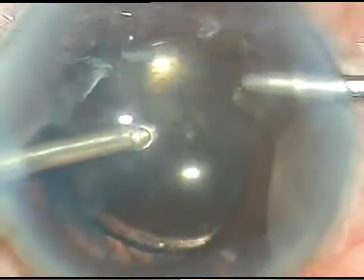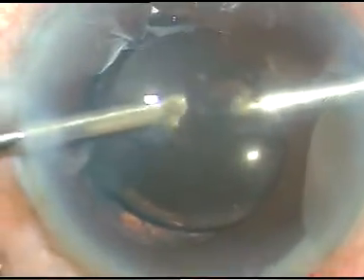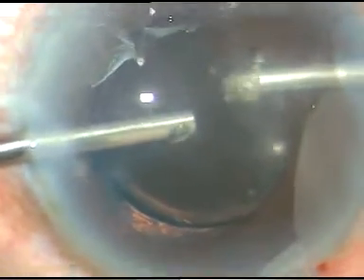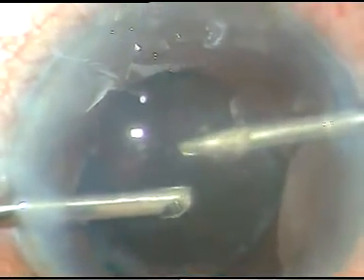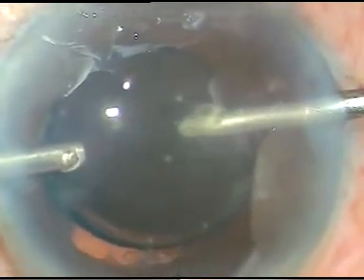Irrigation is through the side port, which is at around 8 o'clock, and the cutter is going through the 2 o'clock side port, and now I am through. The solid epinuclear material has been removed.